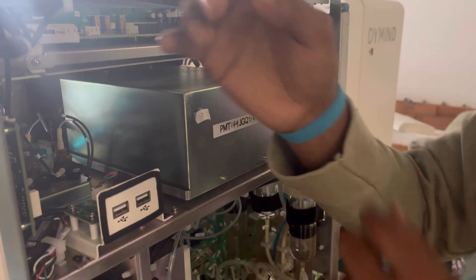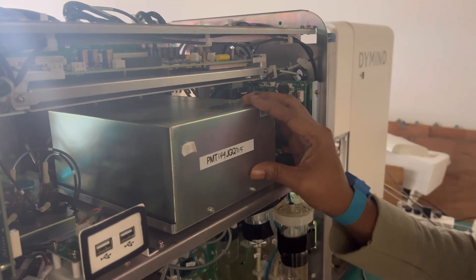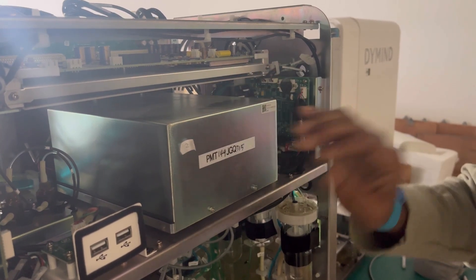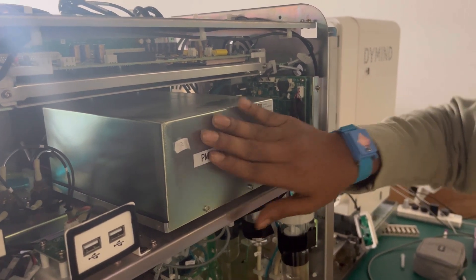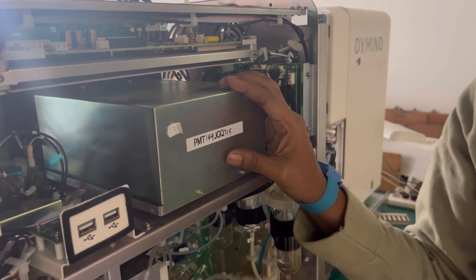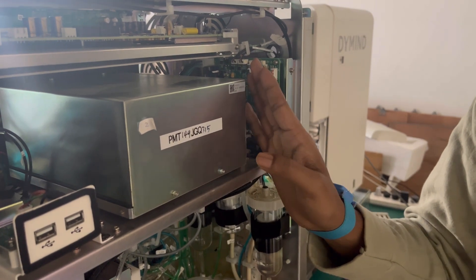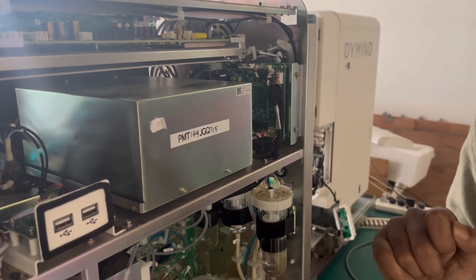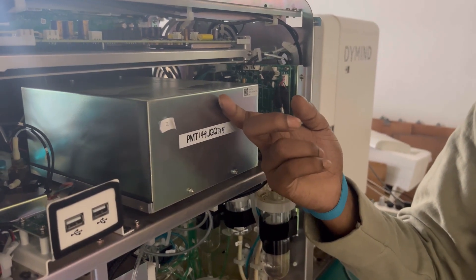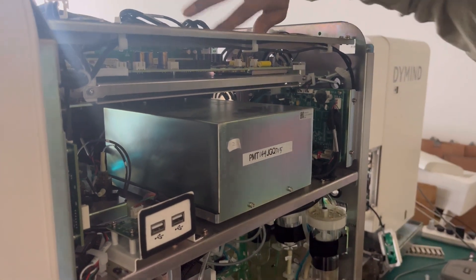Before disassembly, we should wear an electrostatic bracelet, because during disassembly of the optical unit we will touch the main board and other boards, so chips may get damaged if we touch them. Remember one most important thing: the optical unit cover is not allowed to be opened. If you open this cover, sunlight can get inside the optical unit and the unit will get damaged.